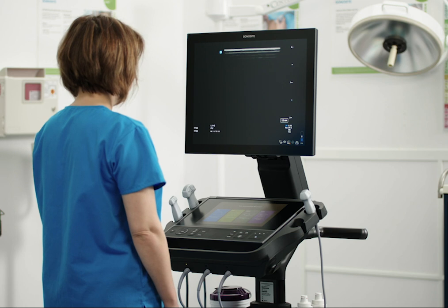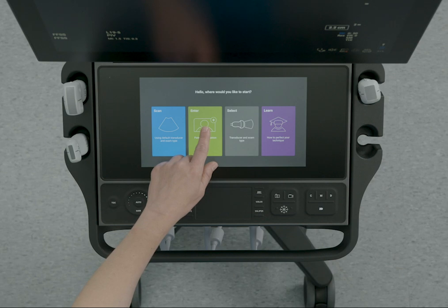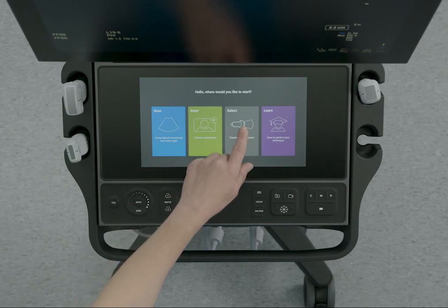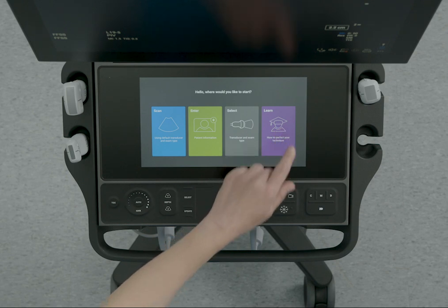There are several available modules to accommodate your workflow. You can start scanning, directly enter patient information, begin with an exam type, or if you want to learn a procedure, access ScanAlong Educational Tutorials.